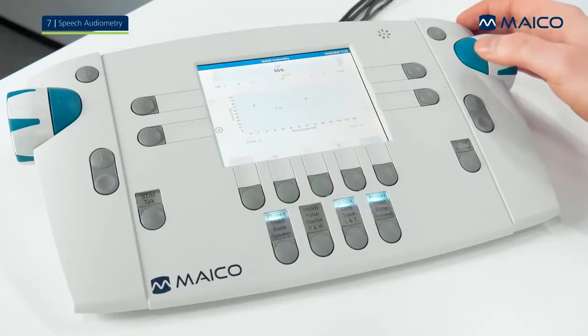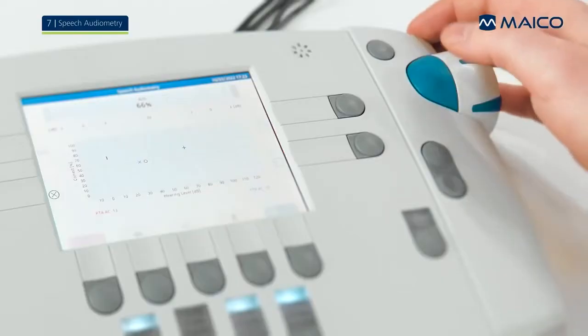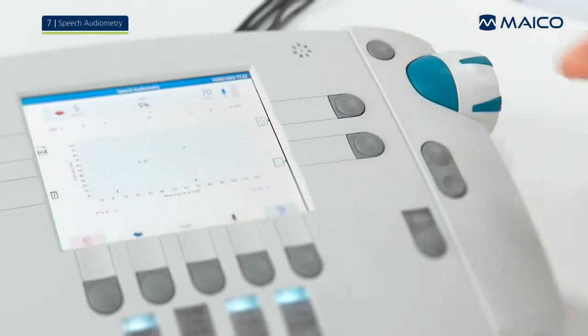House. For WRS testing, the counter can be adjusted using the plus and minus keys. Tree. Sun. Then store the result and continue with another speech test or change the ear side.